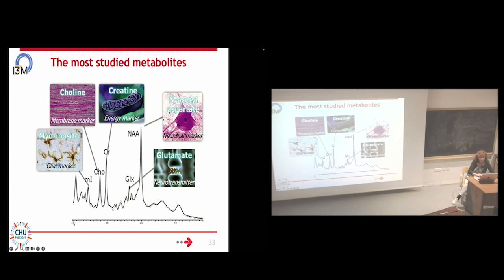So in fact, there are some tables that are reference for the different peaks. And so I cannot give you the absolute value. My colleagues, who are neuroradiologists, know all this well. In fact, when you are not used to it, you have tables regarding the sex, the age period, the period of the day, and you have to compare the value of your metabolites, of the different peaks, with the usual value.